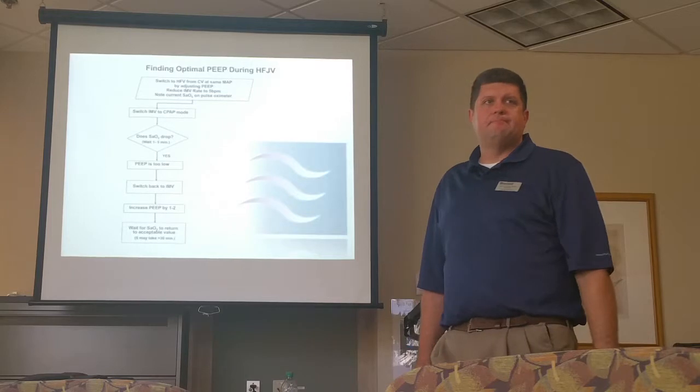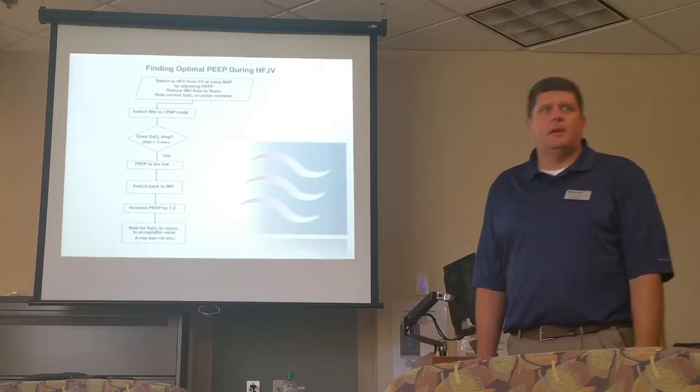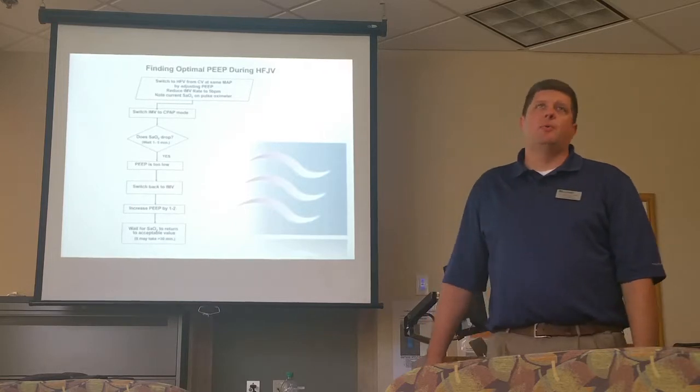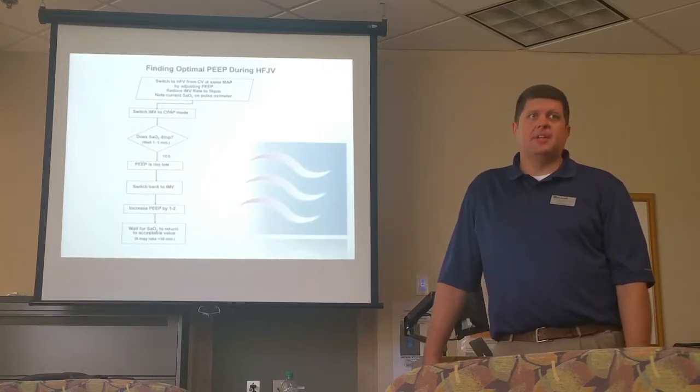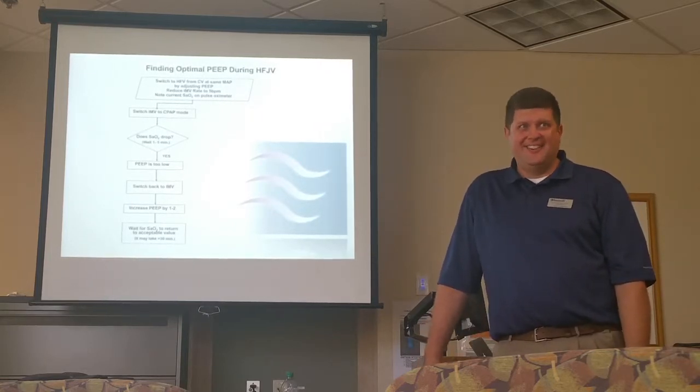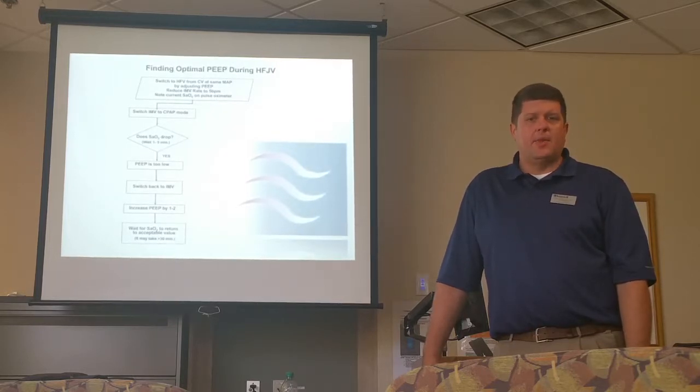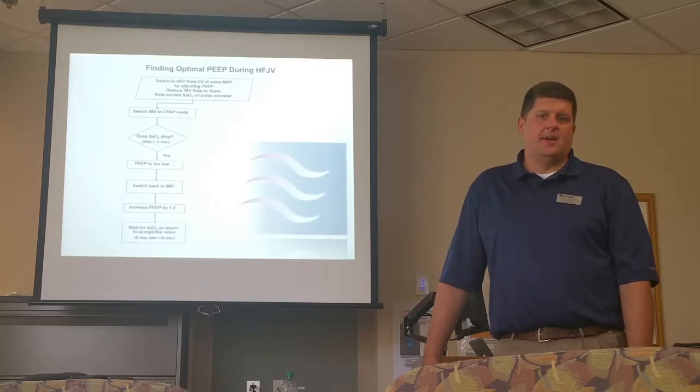Okay. What's the maximum rate that you usually use? 5. There will be times that I'll go maybe to 10 if a patient is actively crashing. Then I'll go to 10, but that's the first thing I've got to turn down, of course. Whether it's a rate of 3 or a rate of 5, I think less is better.